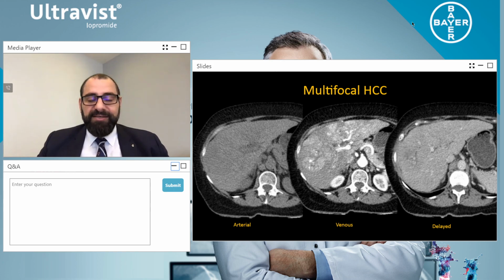But look at the density of the contrast. Did you all notice it's very dense? Did you all notice that the lesions are enhancing beautifully and almost equally? Did you all notice that there is equal distribution of contrast within the liver? Ladies and gentlemen, this was an Ultravist 370 dense contrast with 100 mL saline using a 100 kVp technique. So this is where you have good attenuation. And this is where I really suggest in the imaging we go 370.